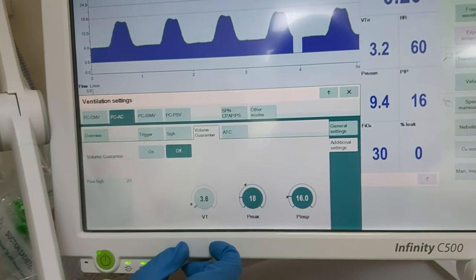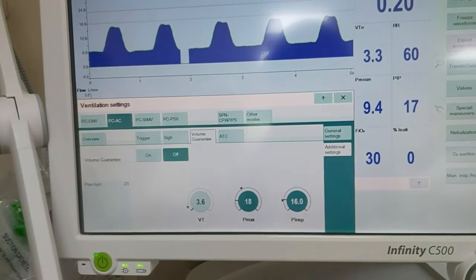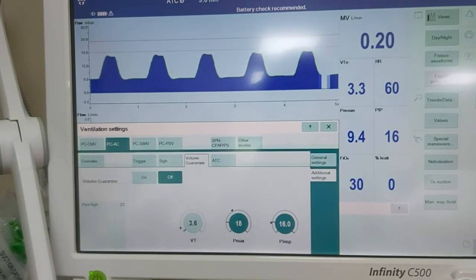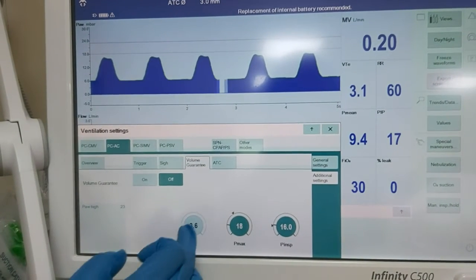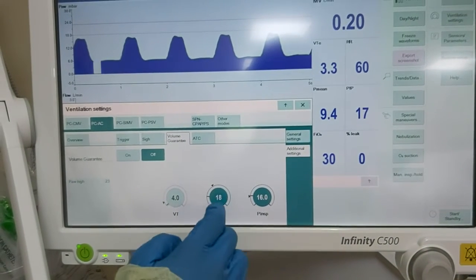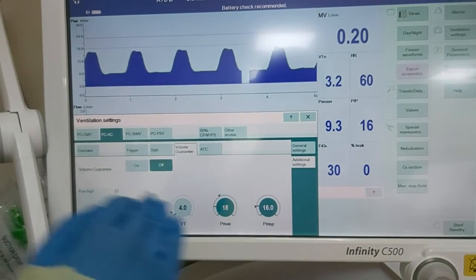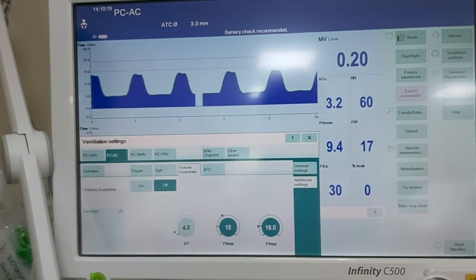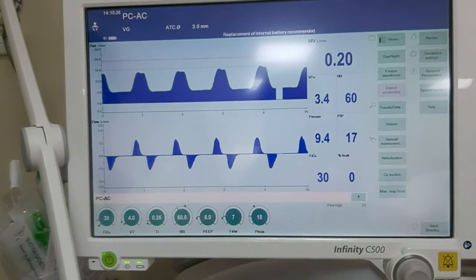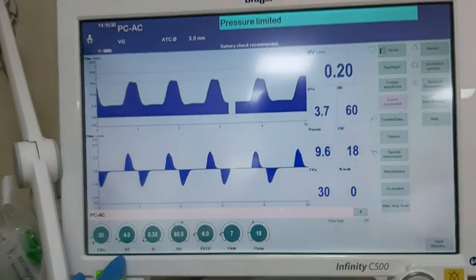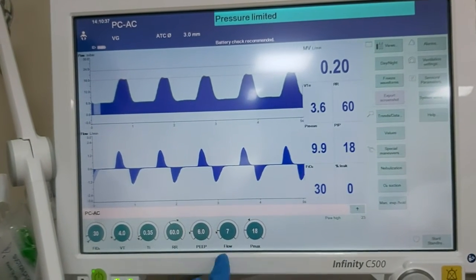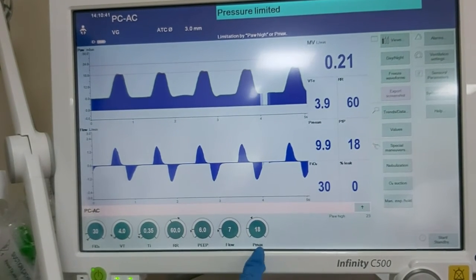We adjust the volume guarantee depending on the patient's weight. For example, this baby's weight is 1 kg. The range is 4 to 6 ml per kg, so 4 ml/kg is appropriate for him. Accept. Pmax — the maximum pressure for this unit — is 18, so I will put it at 18. Now on. It will display here: VG here, and the set tidal volume is 4. There is no set pressure, but there is a pressure limit, which is the pressure max shown here.